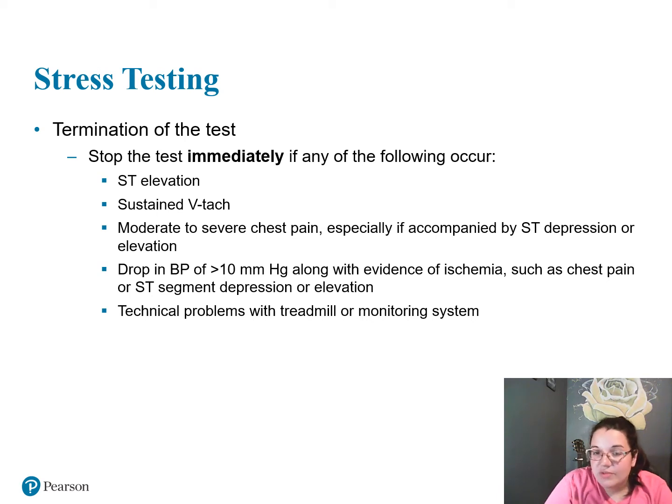So I want you to remember, when a patient is getting an EKG done, whether it's a stress test or a resting test or ambulatory test, we are recording the electrical signals of their heart, right? So if my patient's on a treadmill and they're sweating, could they possibly get electrocuted? Could this be a technical problem or a monitoring system? Yes. So we would want to stop immediately.